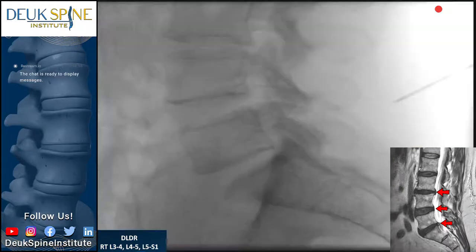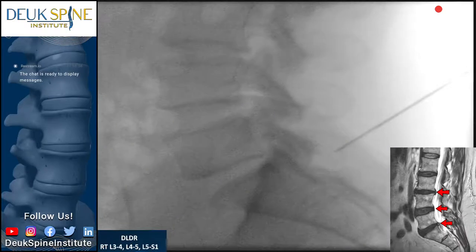All right, looks good. It's a nice trajectory. We're aiming for L5-S1. I've given him a little more numbing medicine. I need my anesthesiologist to make him comfortable. Some more numbing medicine.